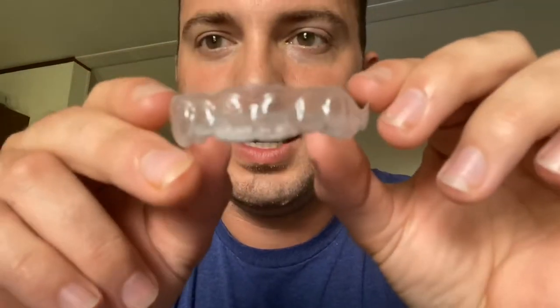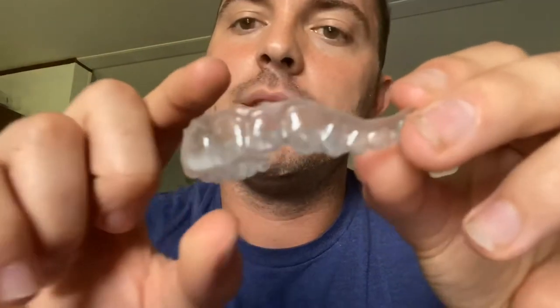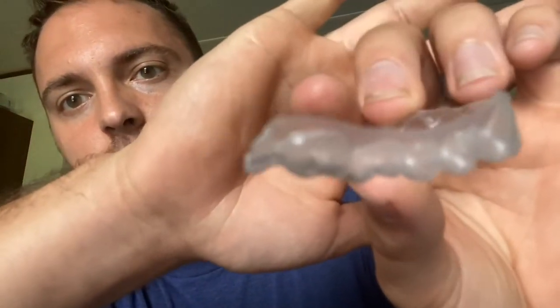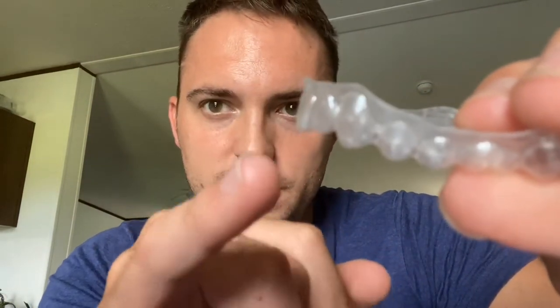I thought the aligner would be a little more transparent but it isn't. This is the size — there's a little dip in my gum there. This is my top aligner. You can also see by this angle my front teeth come forward a little bit — I think it's supposed to be more straight. My bottom row too.